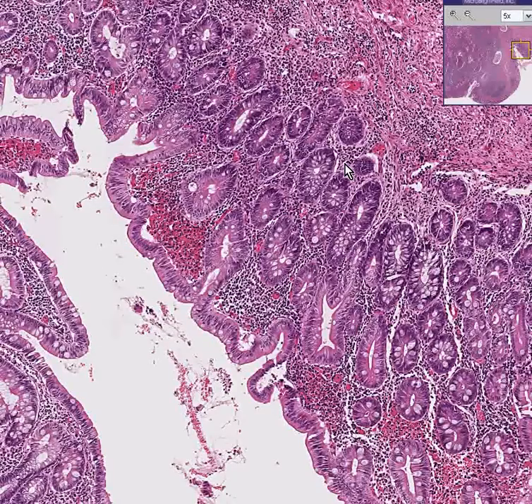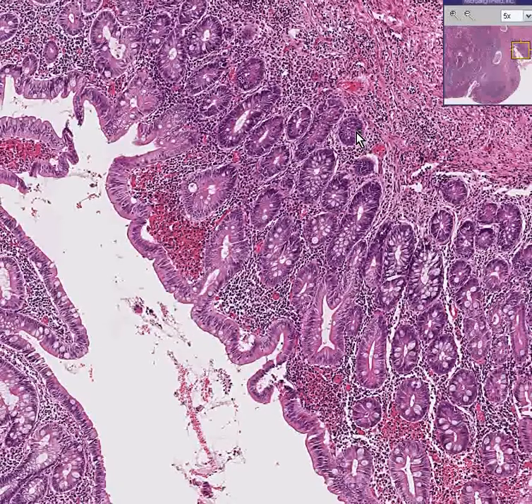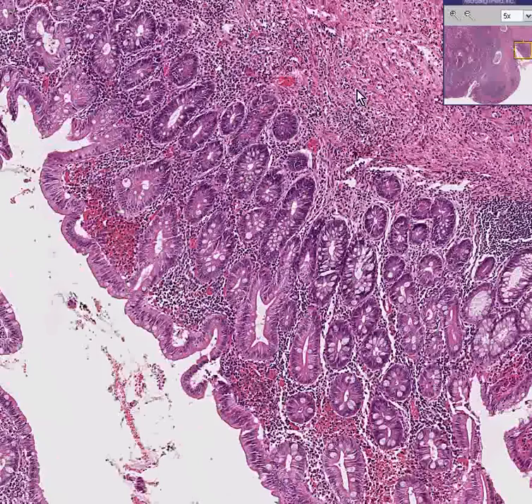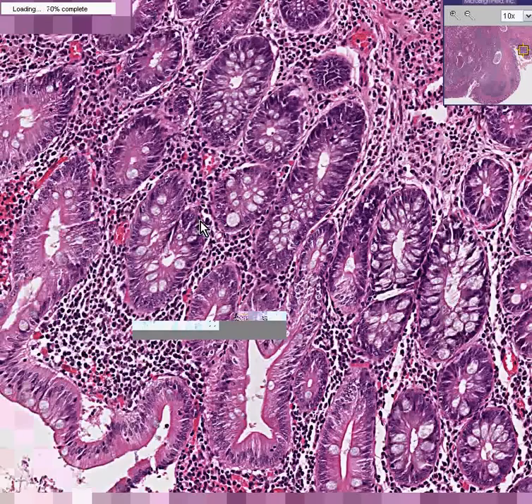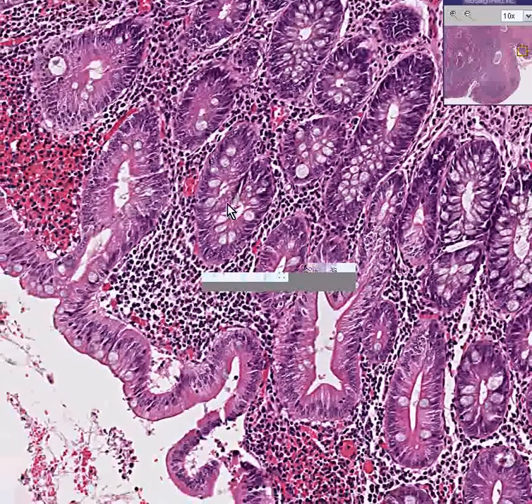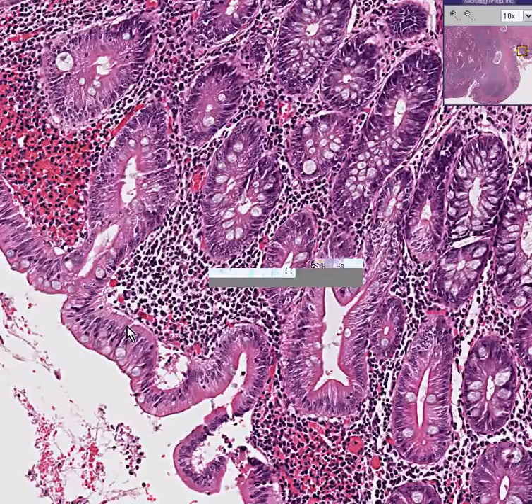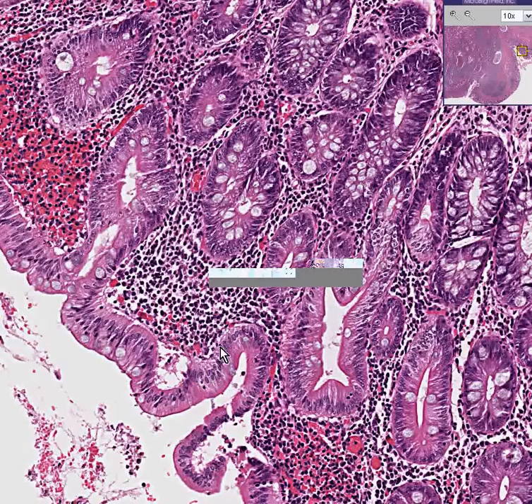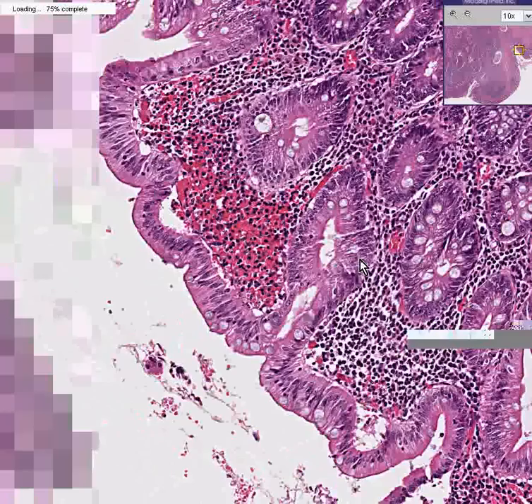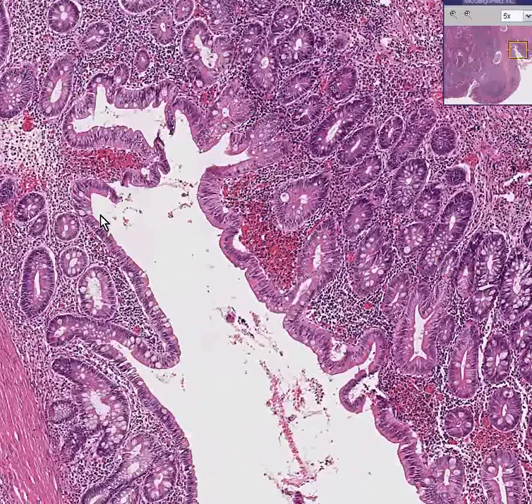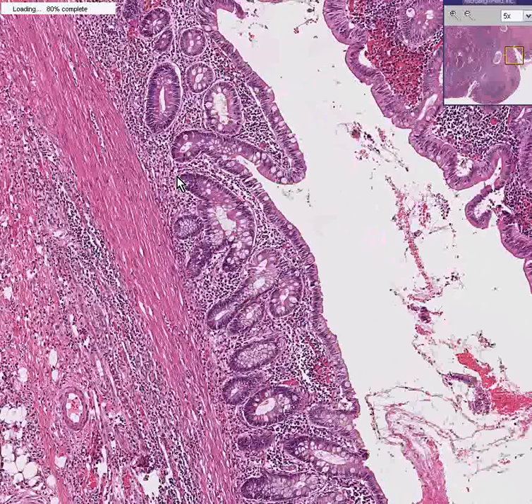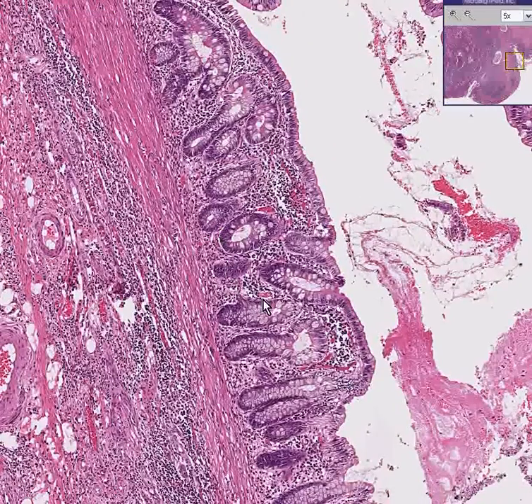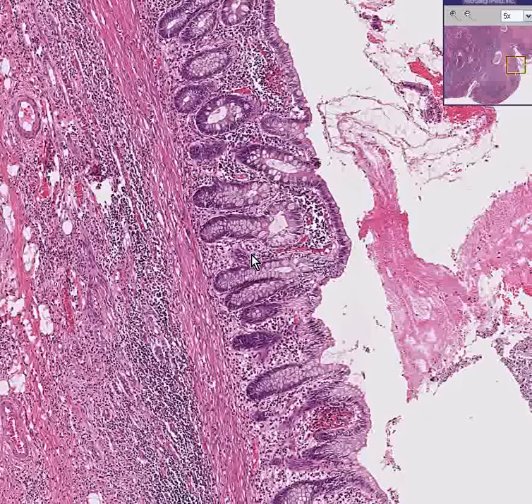Notice another thing about this particular colonic mucosa is that it doesn't have as much uniformity in nuclear staining. There's a good admixture of goblet cells, which is nice, but the nuclei are not quite as uniform as they should be. In addition, as you move out more towards the edge of this colon, you'll see very much of the same changes.